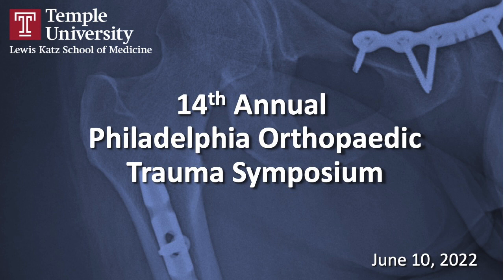Okay. Susan, any thoughts on that topic? Any feel the same way? No, I agree with that. Yeah, the extension of the frame to a safer area is always a good thought to keep in the back of your mind, and you've got to have clean pin sites.